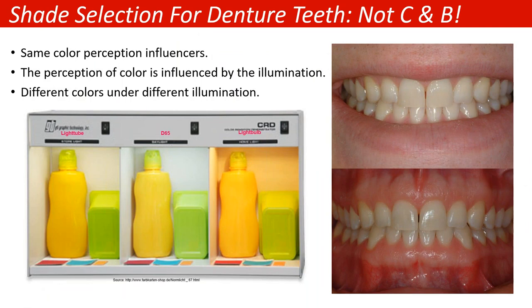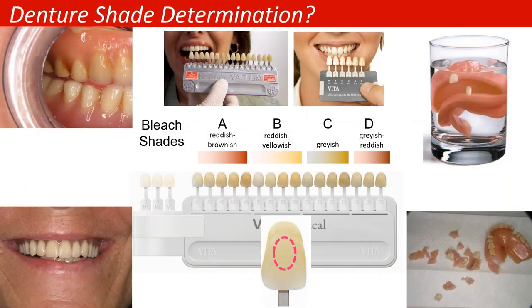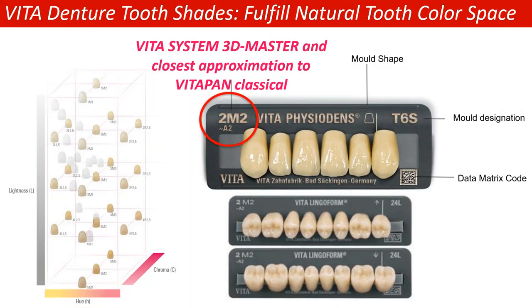You want to, again, assess your environment when you're taking the shade. What is it really you're trying to recreate, and under what lighting conditions? You want to stabilize that, even for dentures, because the patient's expectations are that they blend in and look like the patient wants to look. So taking shade from maybe 16 different shade tabs and hardly ever using any of those shades maybe is not necessarily the way to go. Have them start using those shade molds.